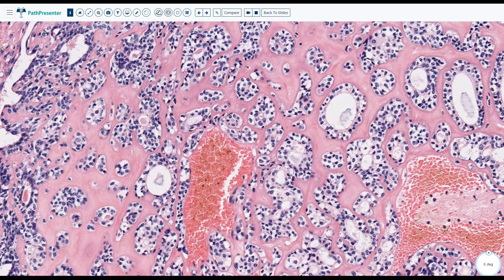It is just, enjoy it when you see it. If you have a case like this, just enjoy it. You don't see it as much. You show it around, you look around, see if there is lymph node metastasis. But usually, if the lesion has clear margins and there is no high grade transformation, which is the problem, it happens in 20% of the time. So be careful not to miss it. Submit the whole lesion, just go through it. Be careful with the margins.